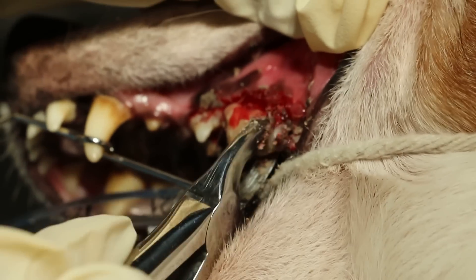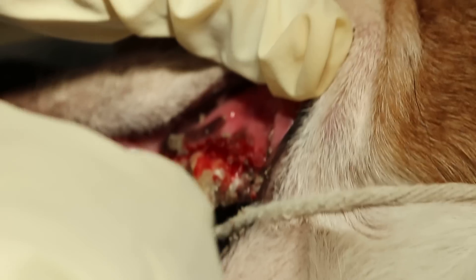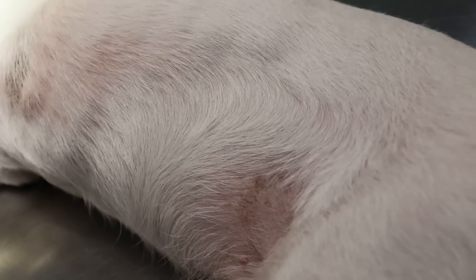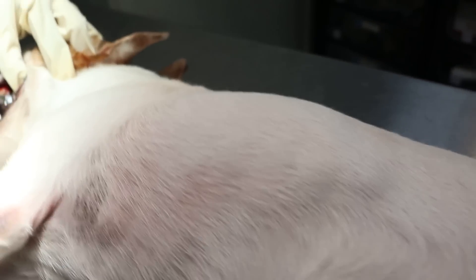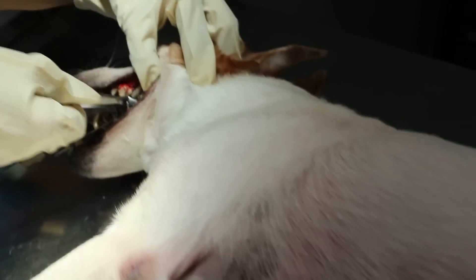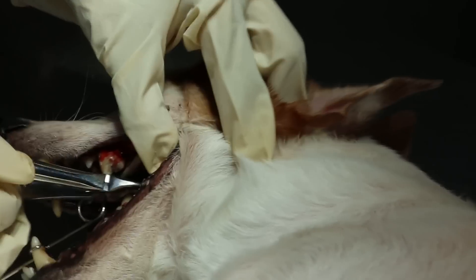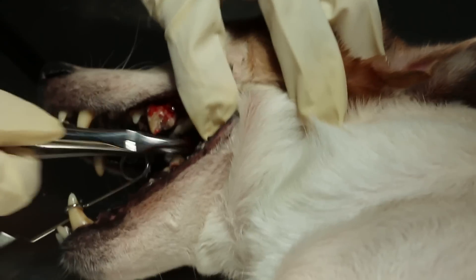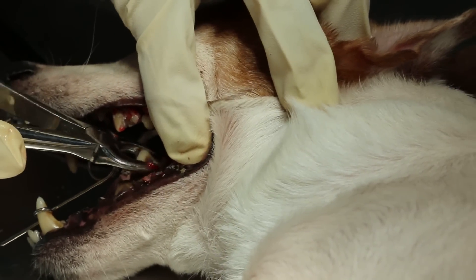There's no more bad breath, or very little, due to the antibiotics given for one week — it's a stomata gel. You can see this is only 50% of the sedation for the old dog. For a young dog I would give 100%. Now we check every tooth for any loose teeth first, and I would say the pre-molar is loose.